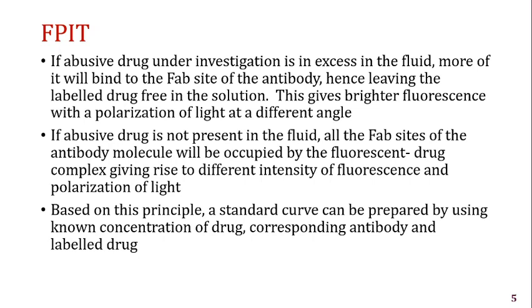So that is how the investigation can be carried out for the samples using a dual technique, that is fluorescence as well as polarization of the light. Therefore, it is called as FPIT.